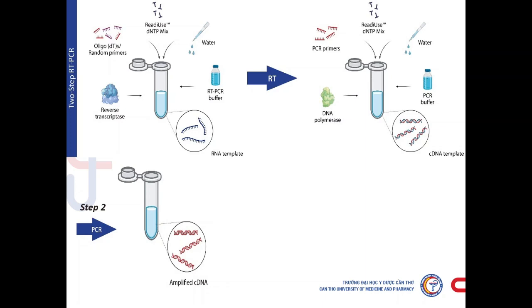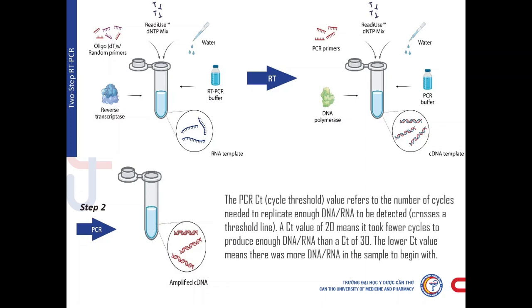In this test, samples are collected from the nose or throat with a swab. Molecular tests detect virus in the sample by amplifying viral genetic material to a detectable level. For this reason, a molecular test is used to confirm an active infection, usually within a few days of exposure and around the time that symptoms may begin.